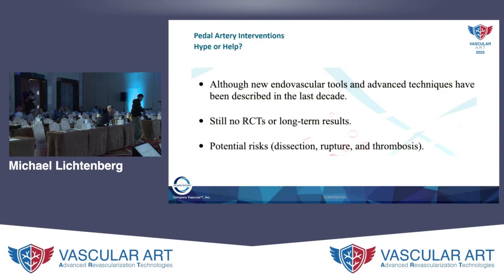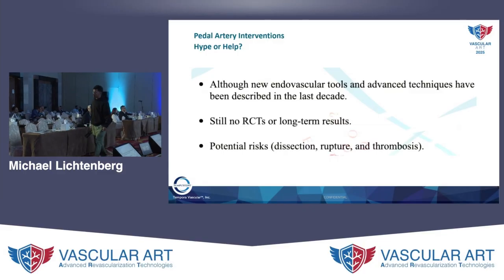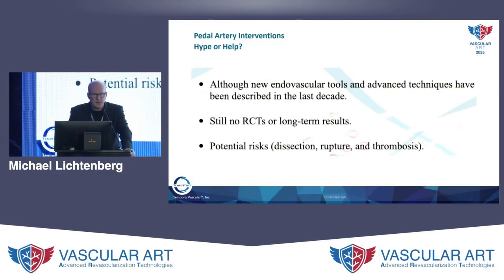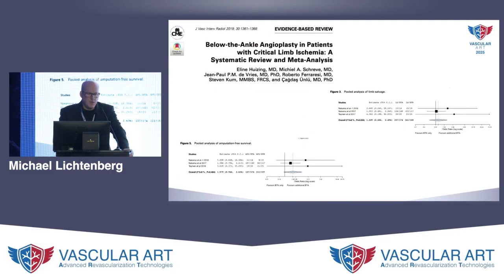If we don't have outflow, the inflow will not be sufficient to heal a wound. So pedal intervention, I think, is absolutely important. Although we have new endovascular tools available, we unfortunately do not have any RCTs. We have small registries, maybe. We do not know so much about risks. But when we look at the data, there are even some meta-analyses. This is a nice meta-analysis from Dr. Ünlü and Dr. Schrewe from the Netherlands. They clearly stated below the knee and ankle intervention is safe and effective.